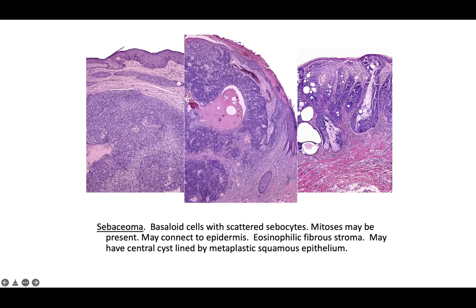Abundant necrosis, clinical growth behavior. A lot of these types of parameters you would expect in any aggressive malignancy. And so, in my opinion, there's no reason to leave a sebaceoma behind. Just excise it because you don't want to undercall a sebaceous carcinoma.